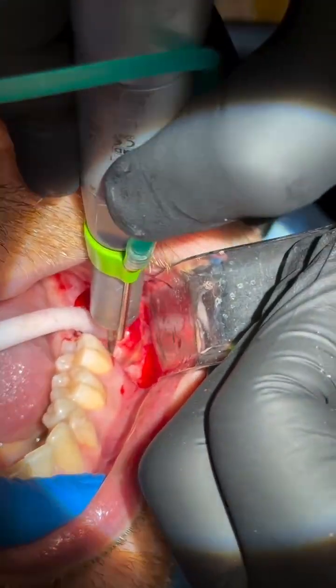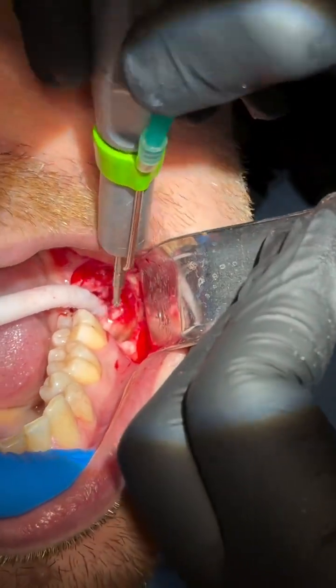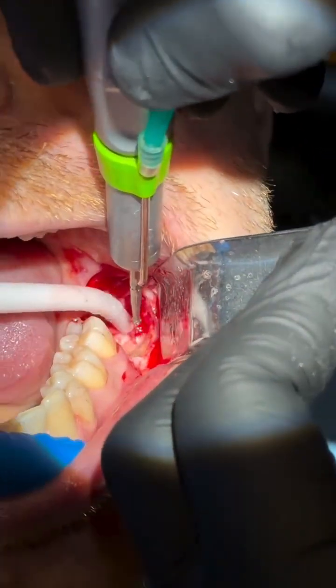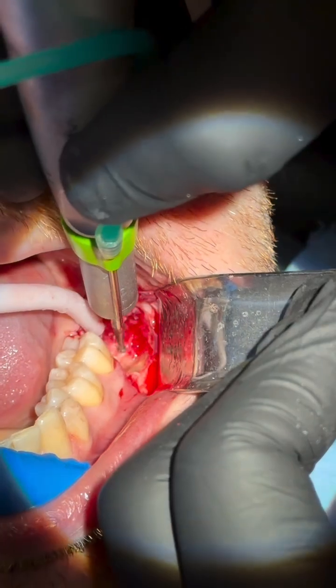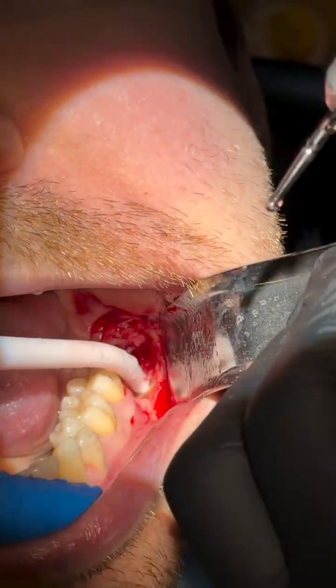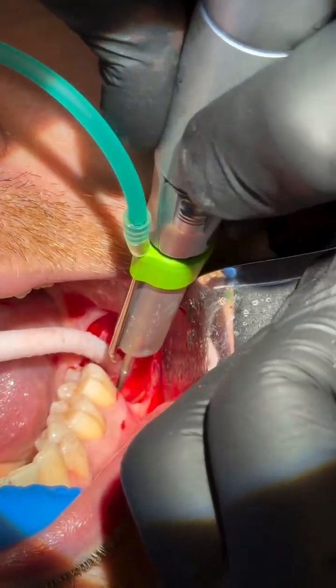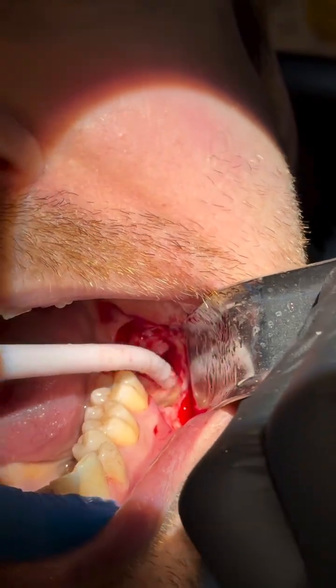I'm smoothing here the enamel spurs and the root surface, again using the same burr. Always make sure there's no enamel left behind.